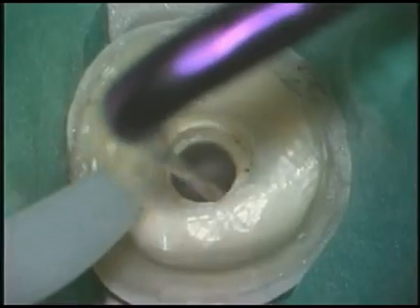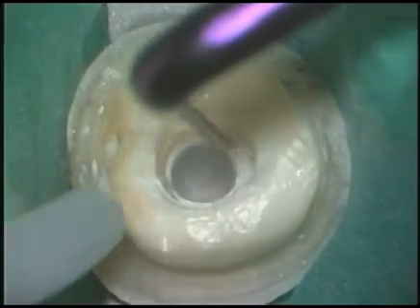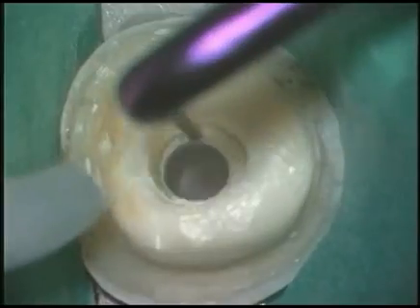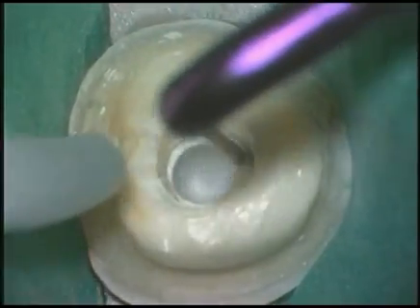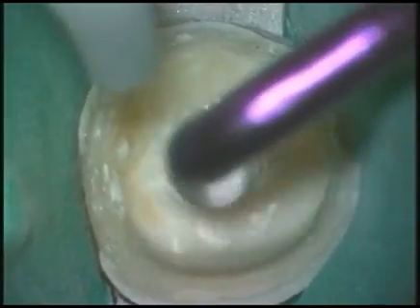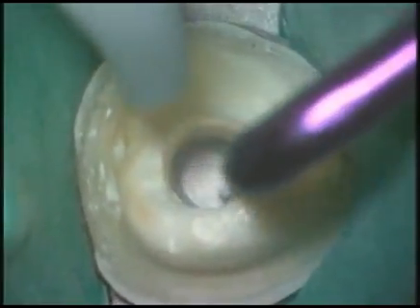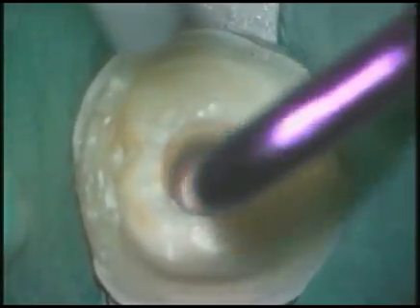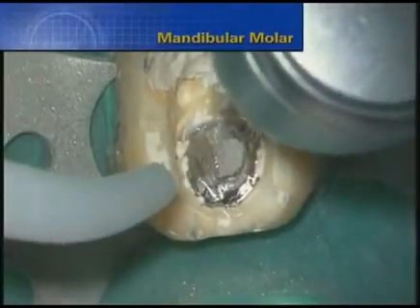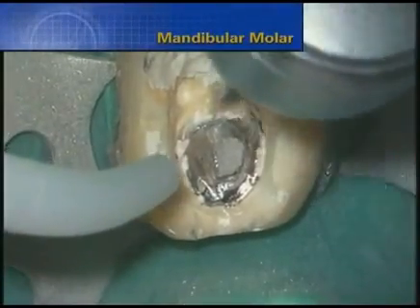I like to select an ultrasonic titanium instrument because of its smooth, efficient cutting action. Notice how rapidly it blows up glass ionomer, which was the material this post was cemented with. In a very quick fashion, the canal is completely cleaned and we see gutta percha. This mandibular molar has a cast post in the distal canal.